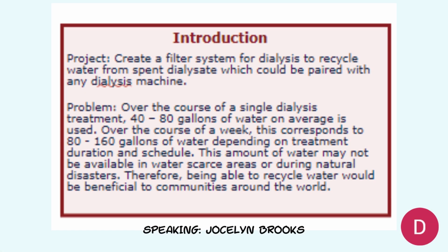So starting off, our project, once again titled Dialy-ssist, is aimed at creating a filter to be paired with any dialysis machine currently on the market. This filter will filter water from the spent dialysate that is created when going through dialysis treatments. The problem that our project is trying to solve is the fact that dialysis takes relatively an enormous amount of water. During one treatment, the dialysis machine will go through 40 to 80 gallons of water. And over the course of a week, this could add up to 80 to 160 gallons, depending on the treatment duration and the amount of days in a week a person undergoes dialysis.